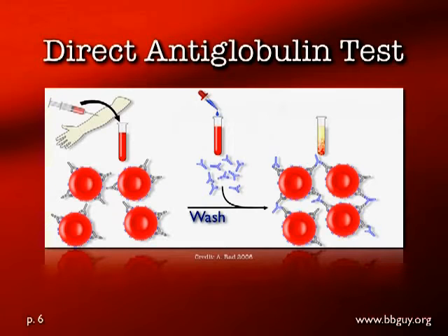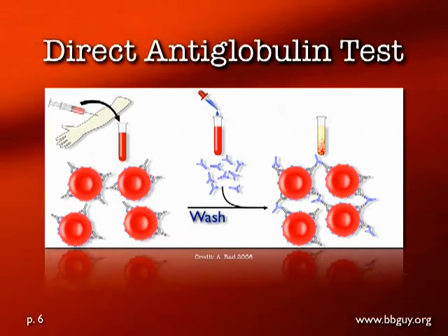Your handout talks about some of the indications and uses for the DAT. We don't have enough time to go into all of those, but there are definitely some useful things that the DAT can help you with, especially in terms of transfusion reaction workups. You can review those briefly in the handout.